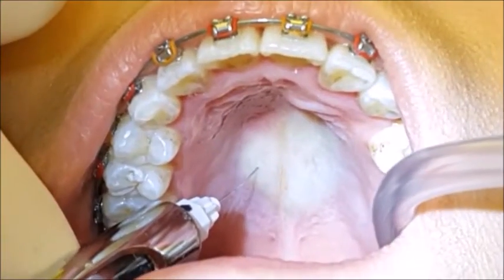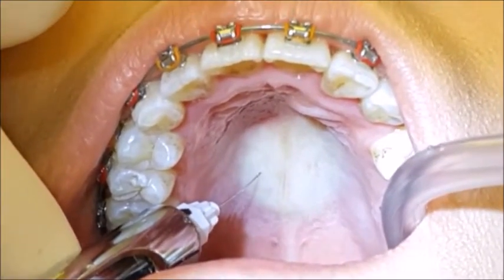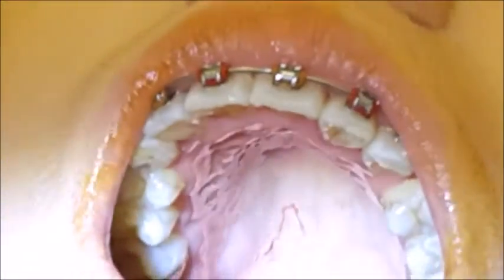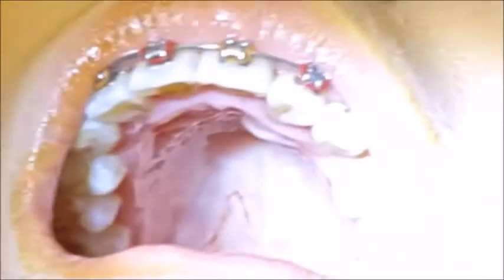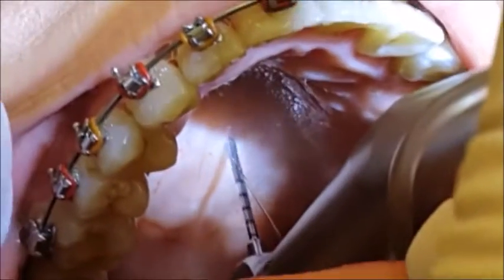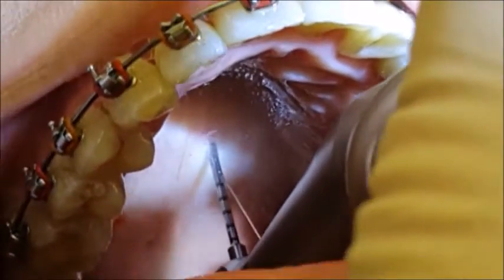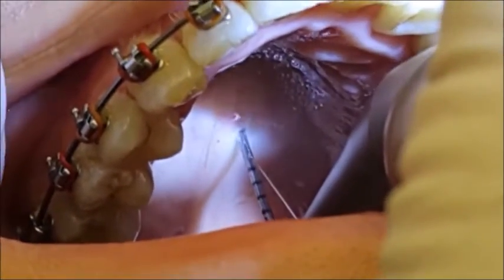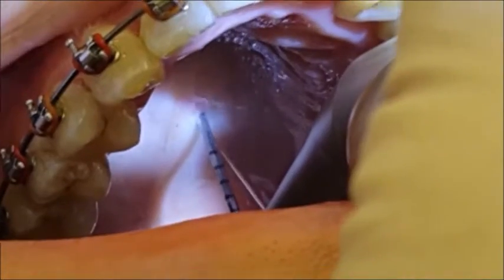Well done - that's it, all done. You did very well; that's the worst part. So here we are starting the pilot drilling, where we just want one or two millimeters into the bone.